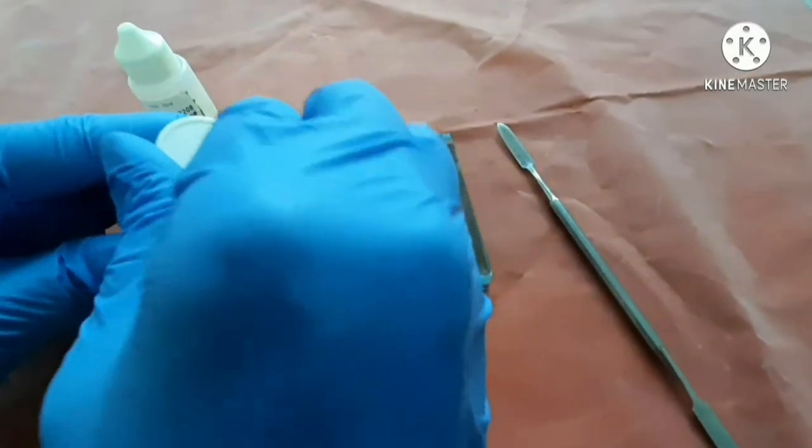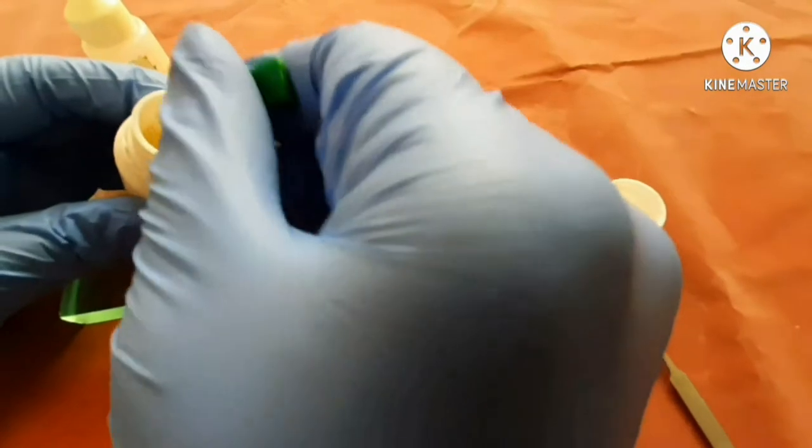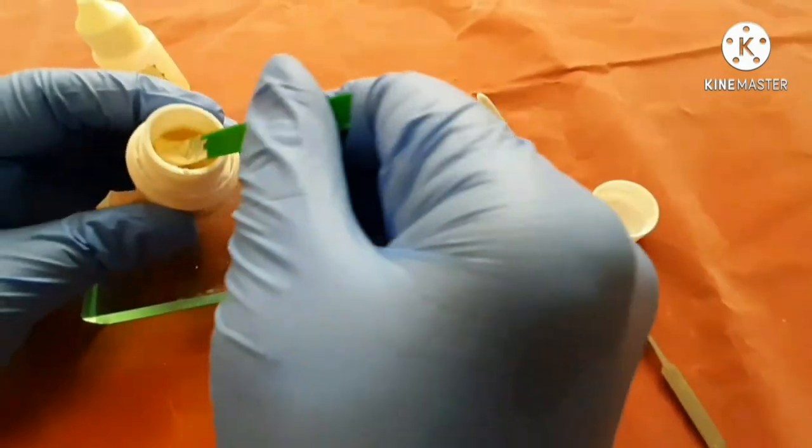First of all, we put zinc phosphate cement in the glass slab by using a spoon to keep the zinc phosphate cement in the glass slab.